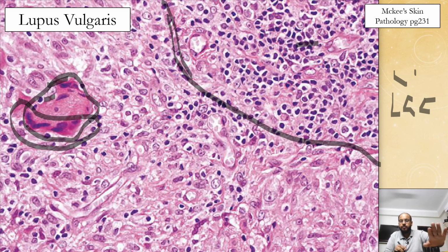It's more pinkish, and you can actually, let me just change the pen. You can see this slipper shape. Okay. Here, yeah, slipper shaped nuclei. Can you appreciate this slipper sole like nucleus of histiocytes? See, these are all slipper shaped, and it's very difficult to actually see the cell membrane. They are more confluent histiocytes. Okay, while above the line you can see majorly the lymphocytes. Let's move forward.